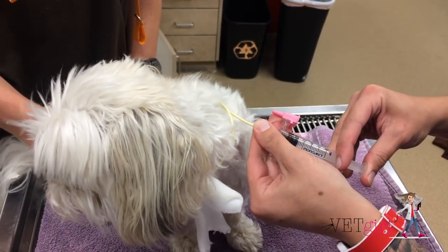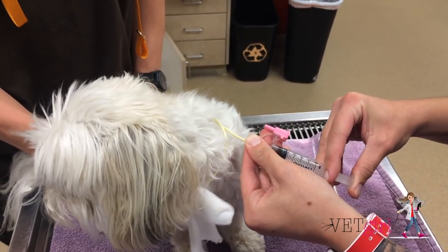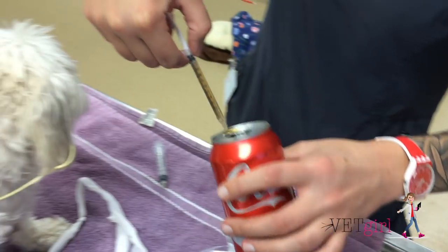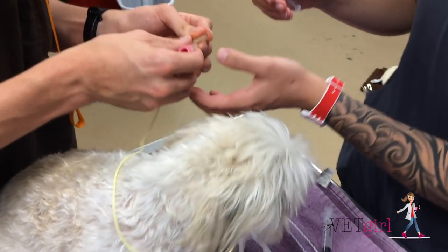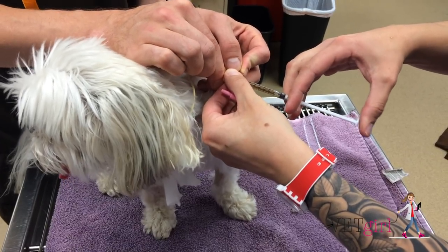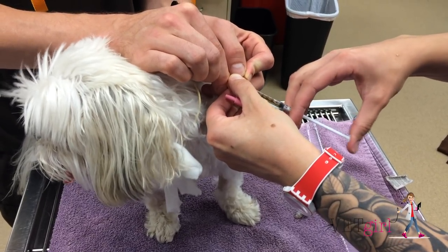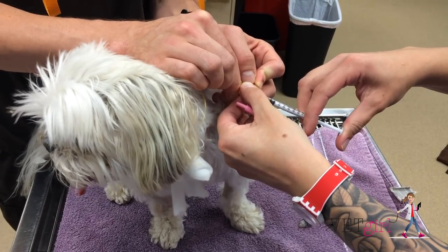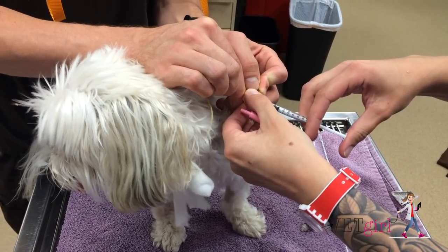While it seems intuitive to use a large syringe to unclog a feeding tube, it is actually technically easier to deliver the Coke or any type of soda via a smaller syringe, like a 1ml syringe. That's because studies have shown that you can actually reach higher pressure, measured as pounds per square inch, or PSI, with a 1ml syringe versus a larger syringe.